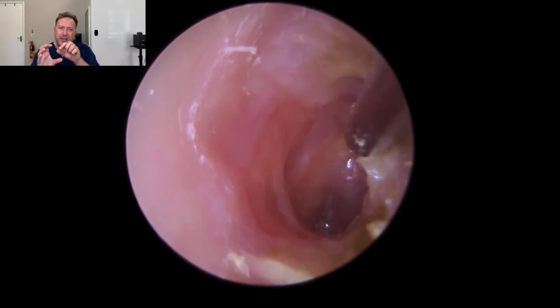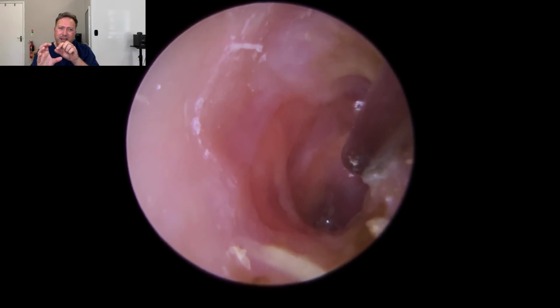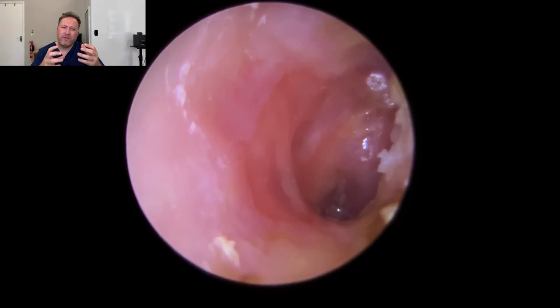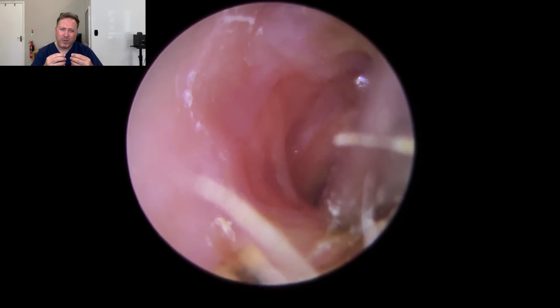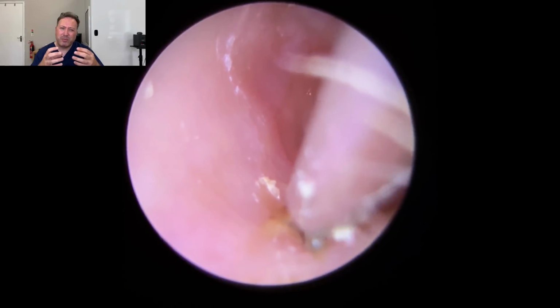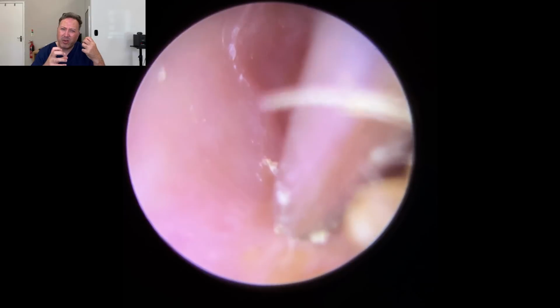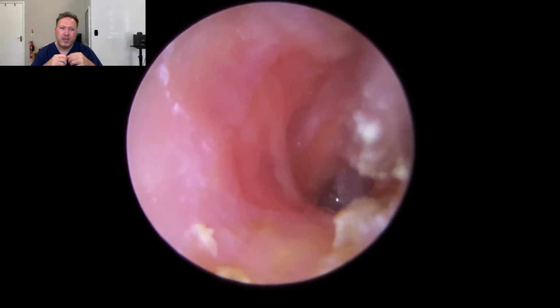We're just going to tidy up this little bit of kind of wet skin material here. With this discharge that comes out of the ear, it's not infection, it's just like a very thin watery discharge, but it can cause some irritation in the canal as this dries up. It causes a lot of itching, and the ear canal can feel quite irritated as well.